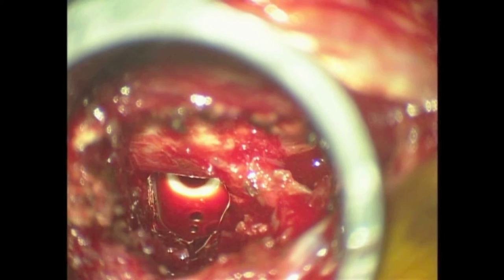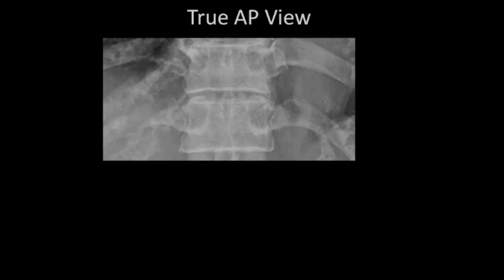Then the percutaneous screws were applied and a RAS system was set up. Obtaining a true AP fluoroscopy view of the intact vertebral level is the fundamental step of percutaneous screw placement.